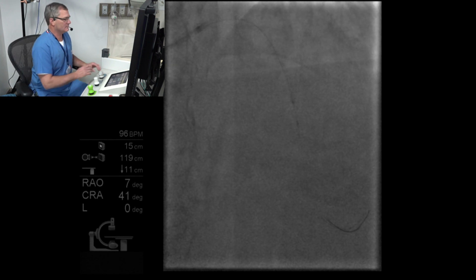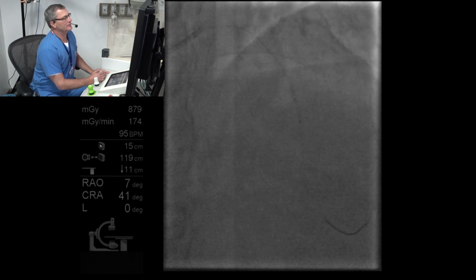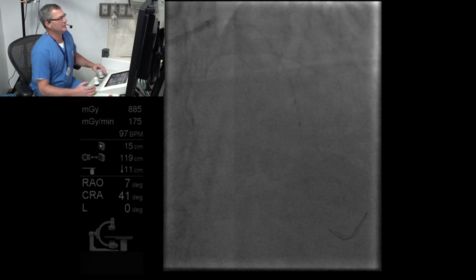I'm sorry. The question is, can you hook up to an assist device and a camera, with all the camera movement behind the robot? Sure. If you have an assist device, it gets to be an awful lot of stuff.